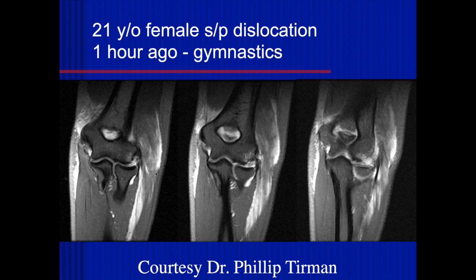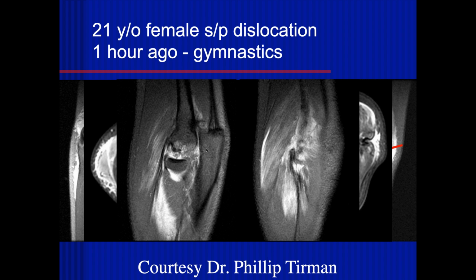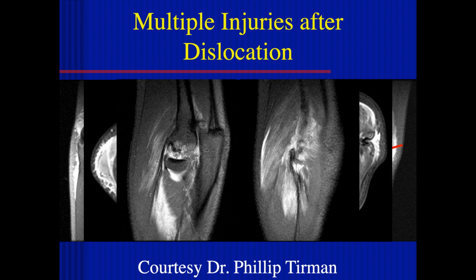So here we can see some bone edema in the capitellum, and it looks like there's some irregularity of that proximal radial collateral ligament. It's probably torn, and also that common extensor tendon origin. It looks like there's fluid signal intensity on the far right image, so that may also be torn. And there's also increased signal intensity within the proximal ulnar collateral ligament, probably at least a partial thickness tear, and muscle edema and some hemorrhage. Yeah, more fluid throughout the muscles and edema.